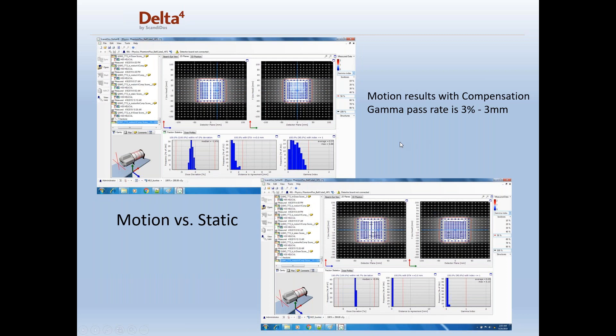In the next pane — the upper left — we are showing motion with compensation. When you use motion with compensation, the gamma pass rate is again 3% 3mm and it looks exactly the same as when there was no motion. In the lower right, they took the motion versus the static and showed the overlap is virtually identical, with that same gamma pass rate of 3% 3mm.